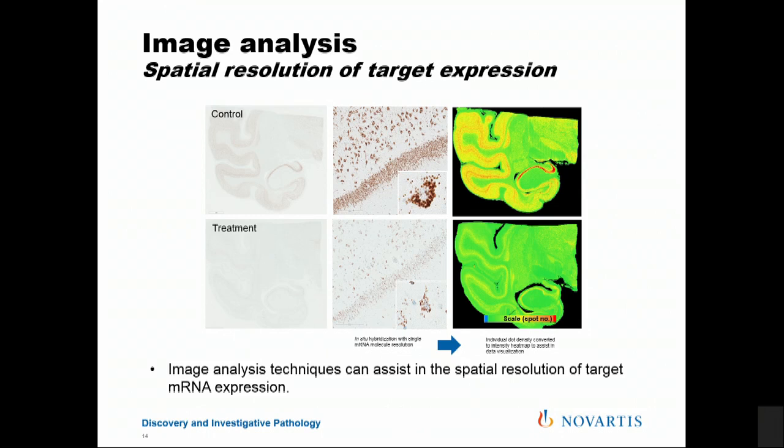A newer technology that's being developed is termed spatial transcriptomics, where we can profile several thousand genes within a single slide and resolve the spatial orientation of changes in gene expression.